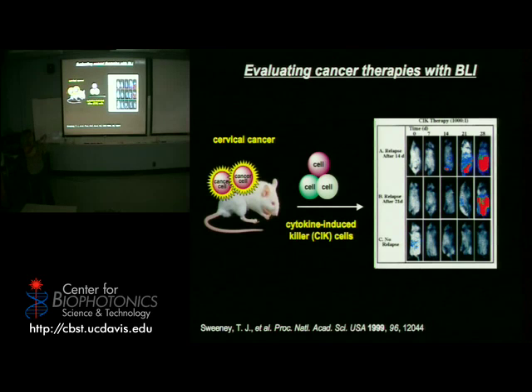And so in this case, we're using luciferase-labeled cervical cancer cells implanted in the animal, and we're treating them with these potent CIK cells derived from the mouse. And at least in the case of cervical cancer, we got a varied output. Again, we're tracking the luminescence of the cancer cells over time. If the therapy is effective, we should see no change in luminescence signal over time. There should not be an increase. However, in some of our animals, we see this big burst of light emission coming from the body, indicating that the cells were not effective at that stage in the animal.